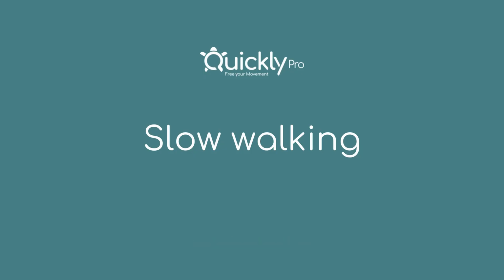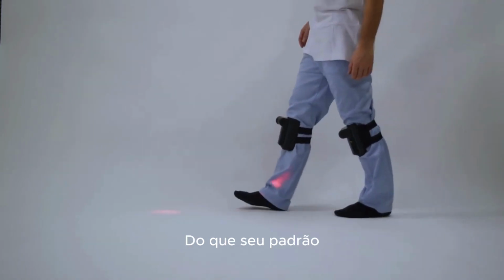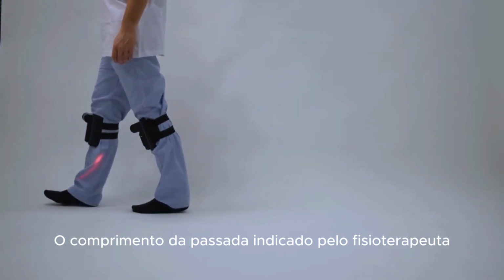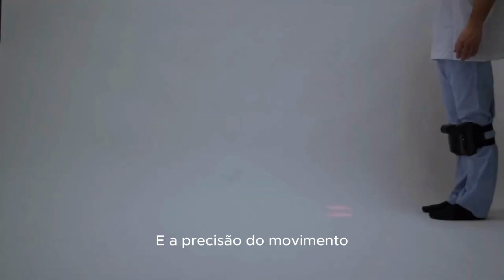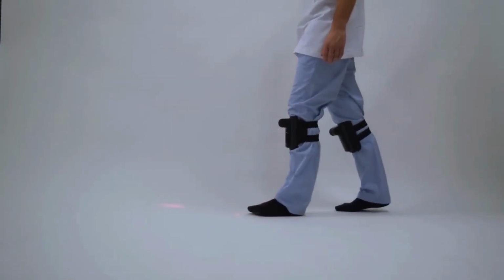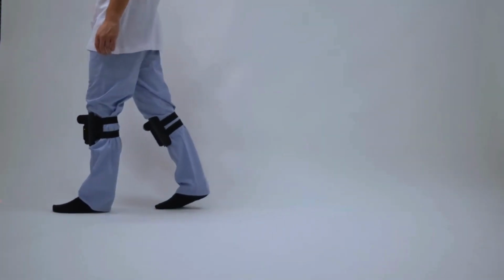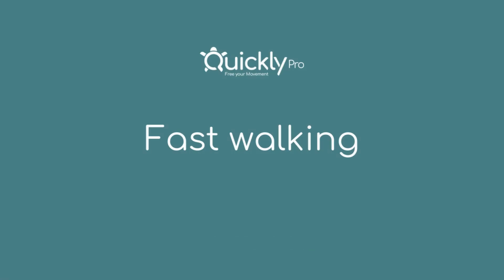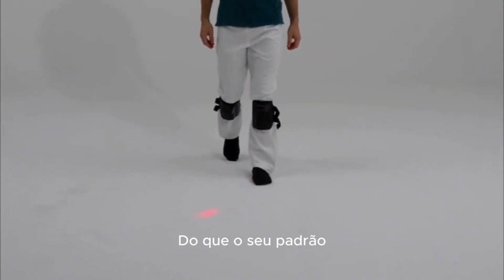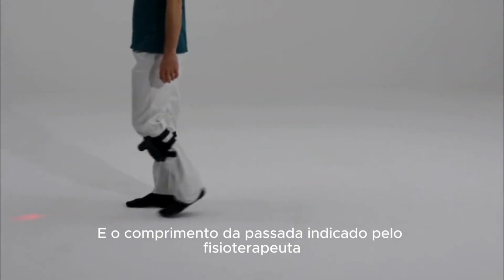Slow walking. In this exercise, the patient is required to walk at a slower pace than their standard. Visual feedback helps to maintain the pace, the stride length indicated by the physiotherapist, and the accuracy of the movement. Fast walking. In this exercise, the patient is required to walk at a faster pace than his or her standard. Visual feedback helps to maintain the pace and stride length indicated by the physiotherapist.